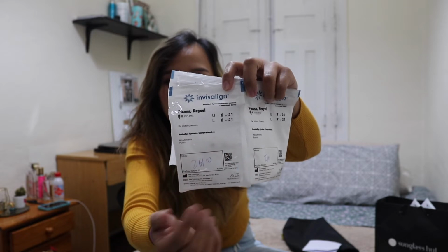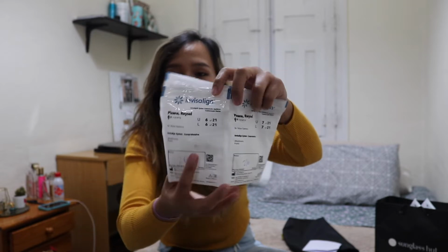It's supposedly just a few months, but after that, your dentist will do a revision to check if it is perfectly done. If it's perfectly done, then they don't do any revision. But in my case, it's not perfectly done, it's not almost aligned. So I am expected to undergo a revision and get another set of liners, I think another 15, to have perfect alignment in my teeth.